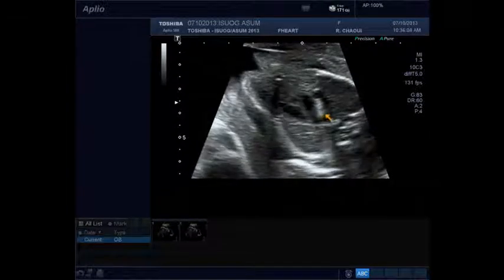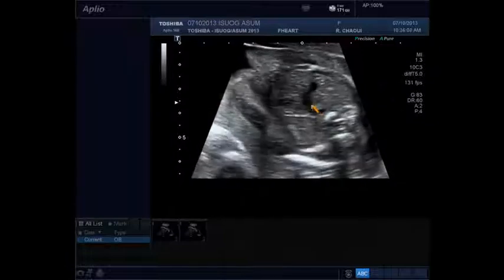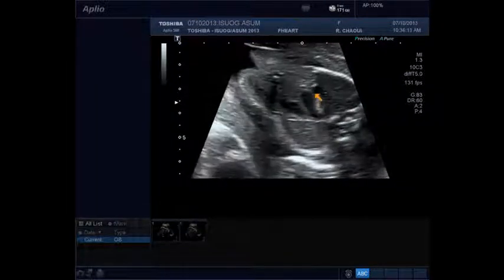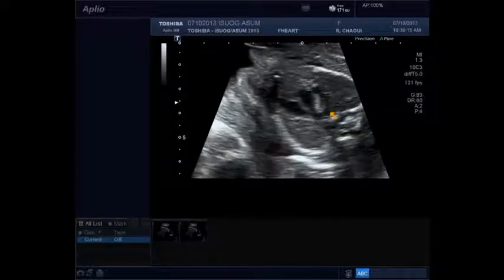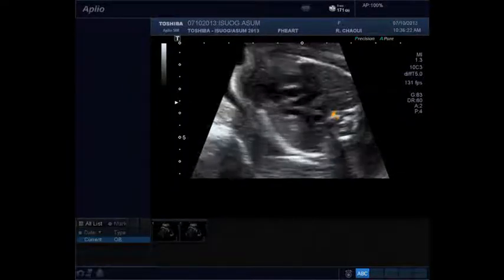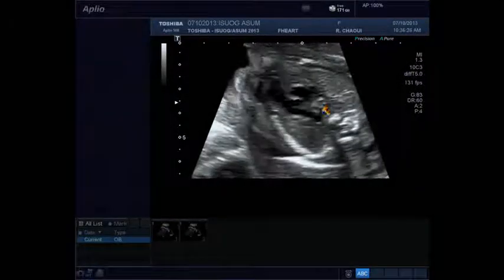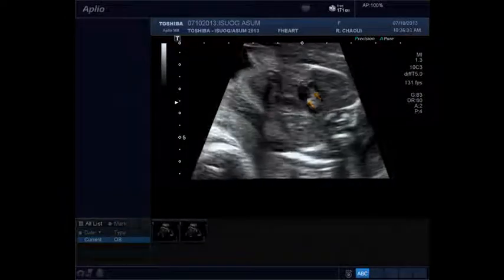It is the position in comparison to the trachea, which is this echogenic dot seen here, and this is a normal condition. Because we have a high resolution here, you can see even this black part, which is the azygous vein, which is very tiny here, near the descending aorta, going up and entering the superior vena cava.